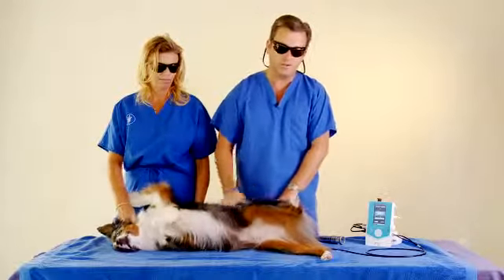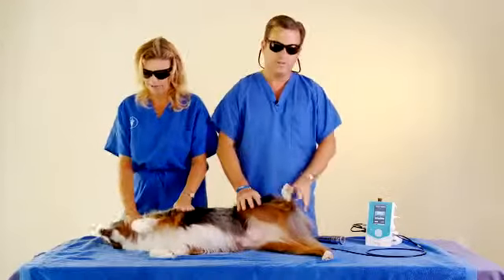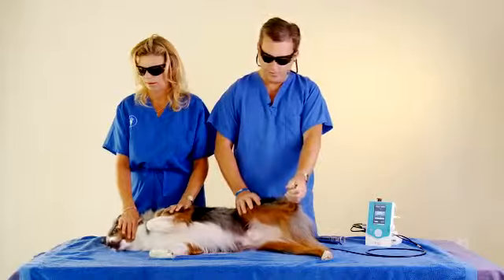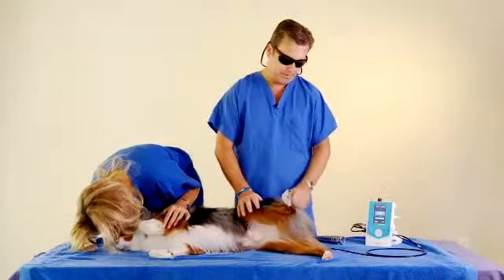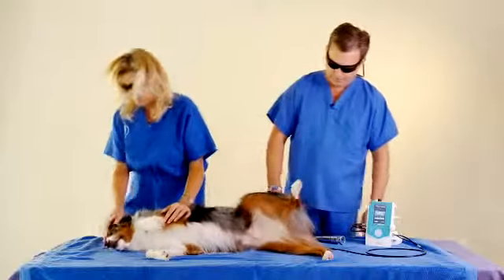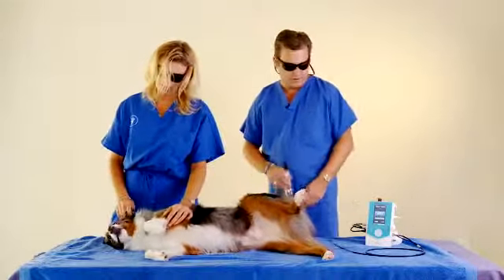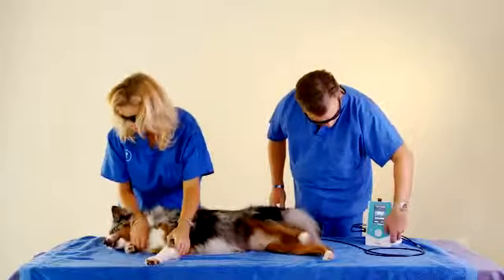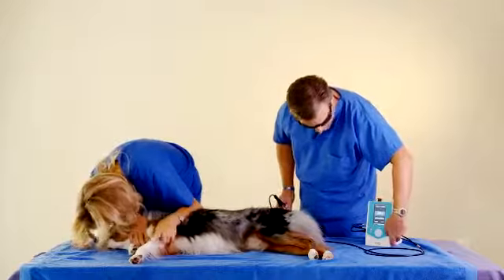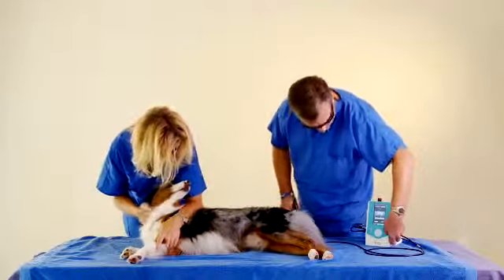So don't just think of surface area in 100 centimeter squares. Think of the volume of the area that you're treating. The volume of his paw is very small compared to what a Newfoundland might be, or also the volume of his hip. So with that in mind, those are some things to consider when you're treating, and you can change your settings based on your clinical judgment, but keep those in the back of your mind when you're evaluating and treating the animal. So get ready.